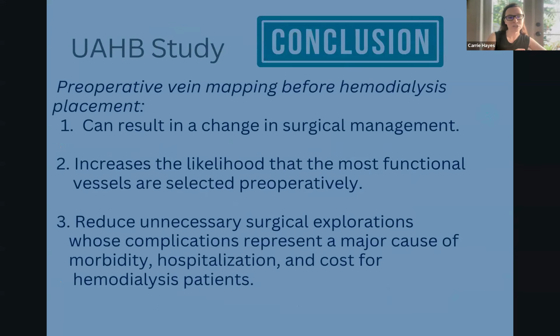So the mapping can change surgical management. It increases the likelihood they're going to get the most functional vessels selected preoperatively. It reduces unnecessary surgical explorations. Those complications can cause morbidity, hospitalization, and then more cost for hemodialysis access patients.